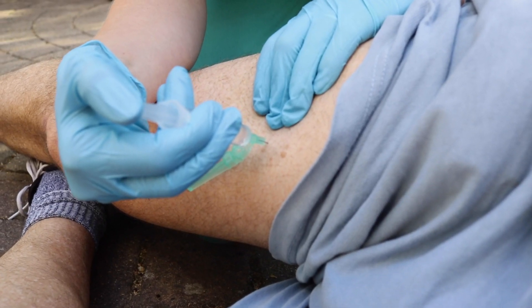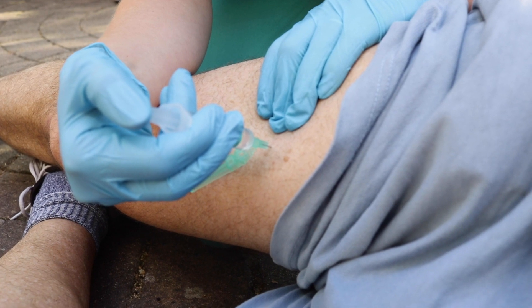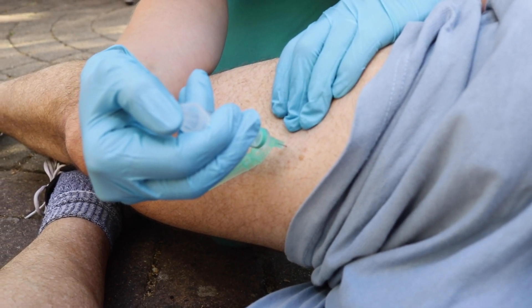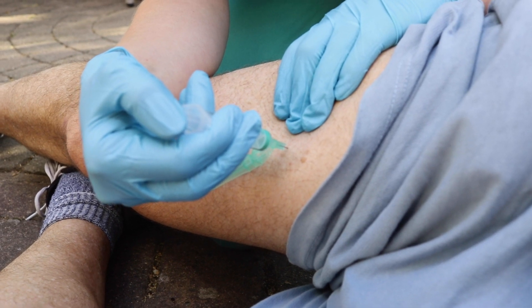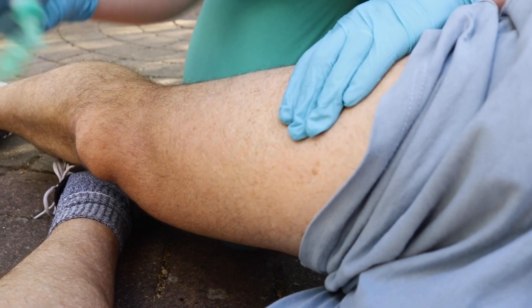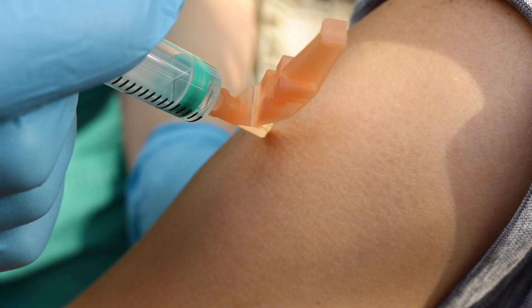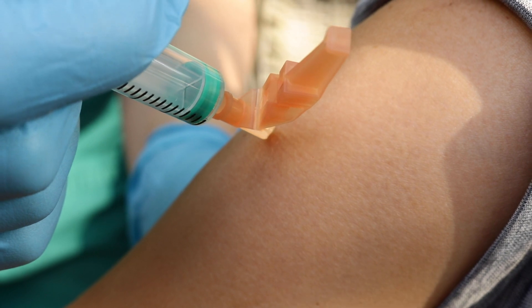The 500 milligram dose of tranexamic acid or placebo can be given to most patients as a single 5ml injection of 100mg per ml. But if the patient has small muscles, it can be divided into two 2.5ml injections.